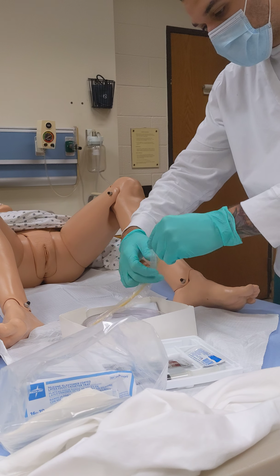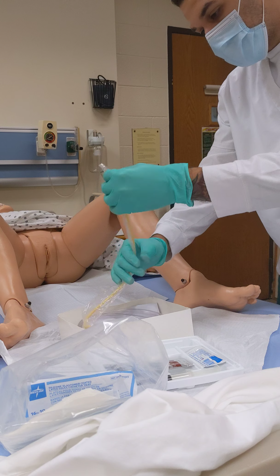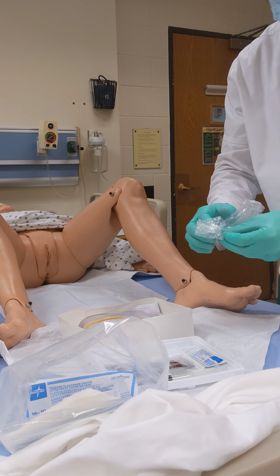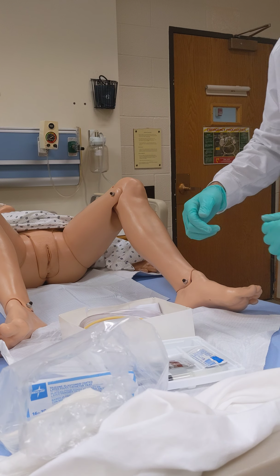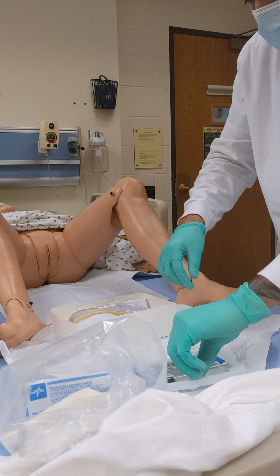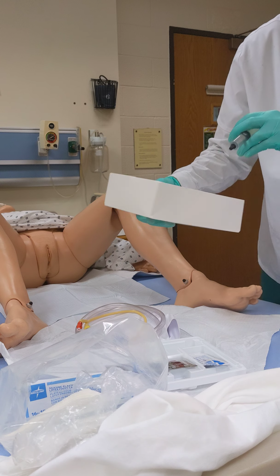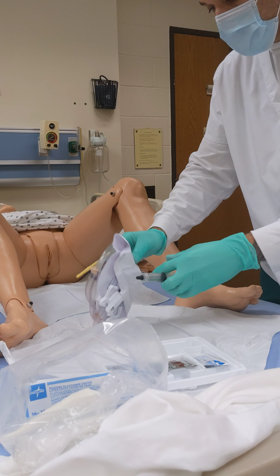I'm going to start by removing this plastic slip here off the catheter. Place the box here for right now, just so that I have more room to work with.